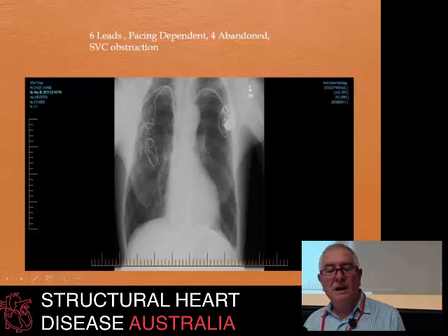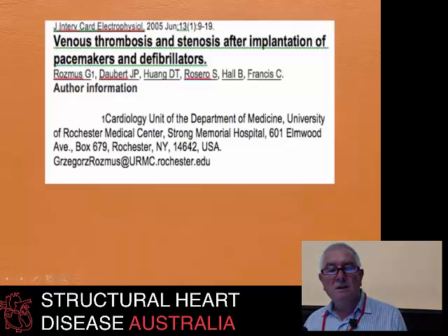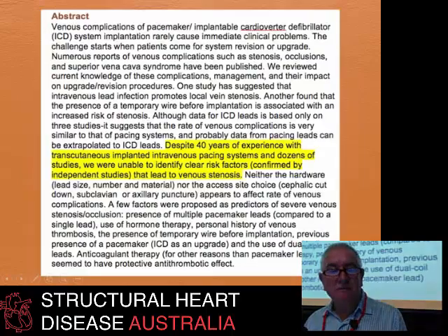I took these leads out, but I'm afraid this process had been going for too long and it really didn't do him a great deal of good. So venous thrombosis, another complication.